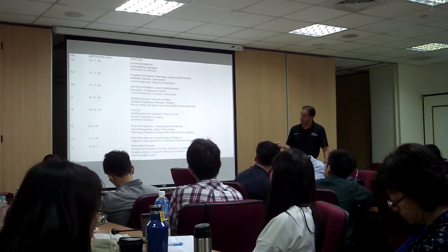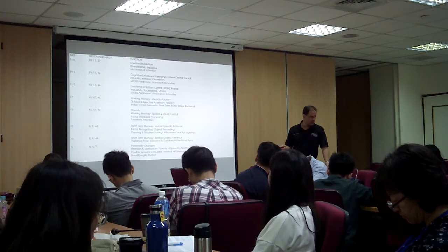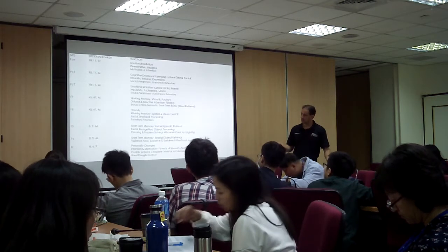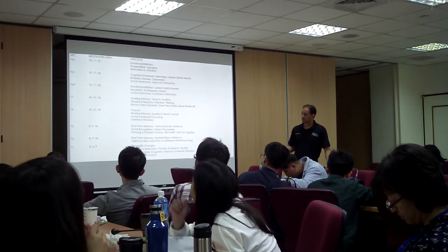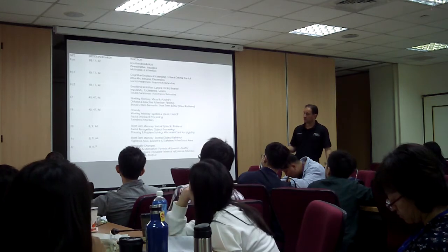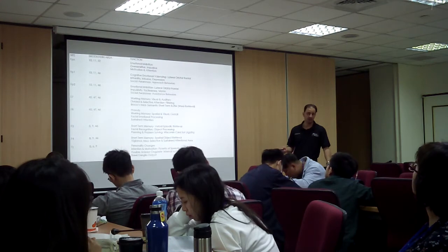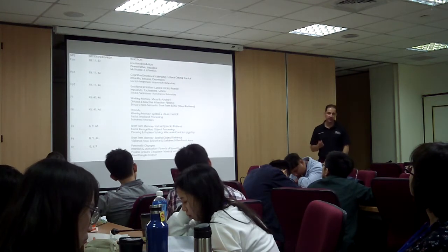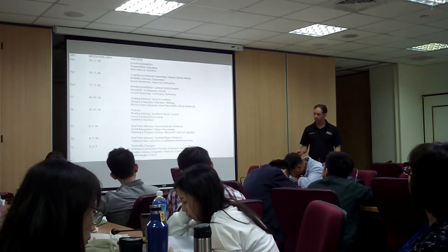So again, F7 is good for anything that's stuttering, stammering, tip of the tongue phenomena, talking with a lisp, anything that's motor language related. F7 is a good point, and T3 as well. F3, good for executive functions and depression. If there's an alpha asymmetry, if there's more alpha at F3, then we train at F3. If there's nothing at F3, we leave it alone. Okay.